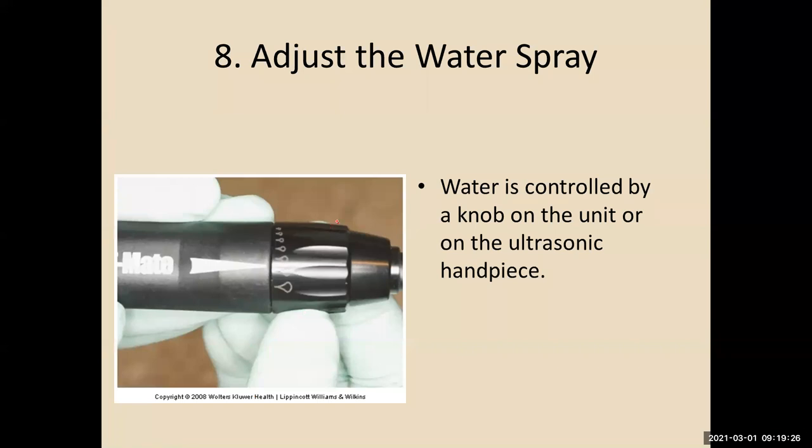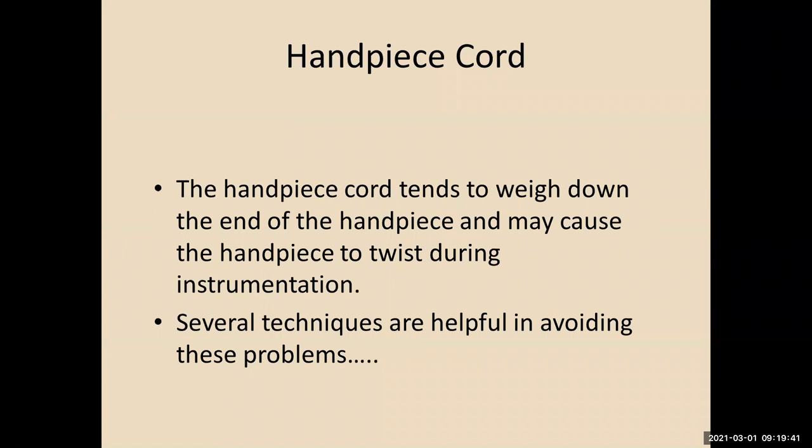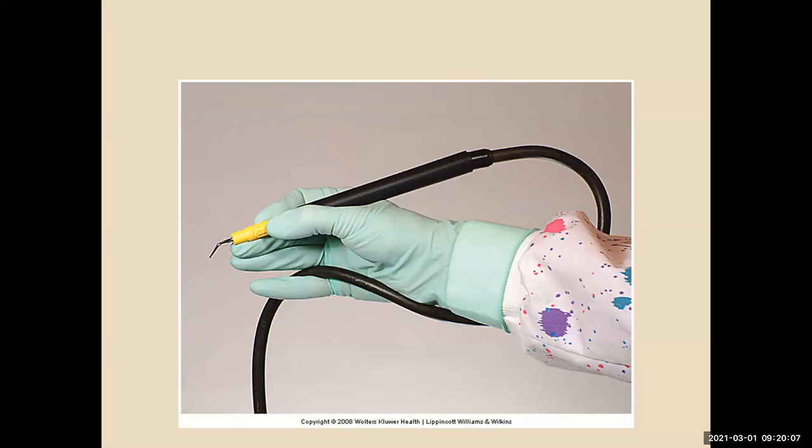Your water adjustment happens to be blue. Check the spray for a fine mist. And then for cord management, there's a couple different things you can do. One is wrapping it around your wrist this way, because what's going to happen is you're going to get pressure and the weight is going to be this way. And eventually it's going to fatigue you. This is another way to handle it.